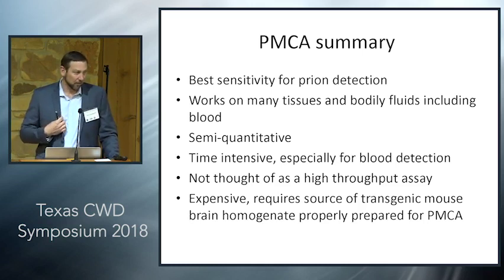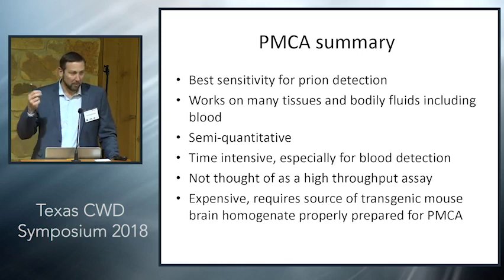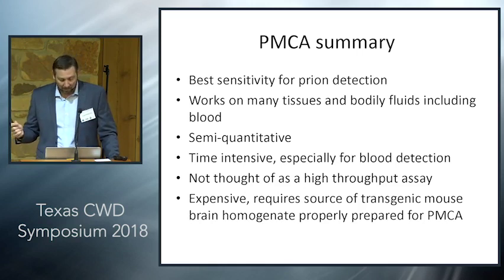It's not a technique that I use, but in the literature there are so many different types of samples that have been used with excellent sensitivity. It can be semi-quantitative depending on when the round becomes positive. You can determine how positive a sample is.